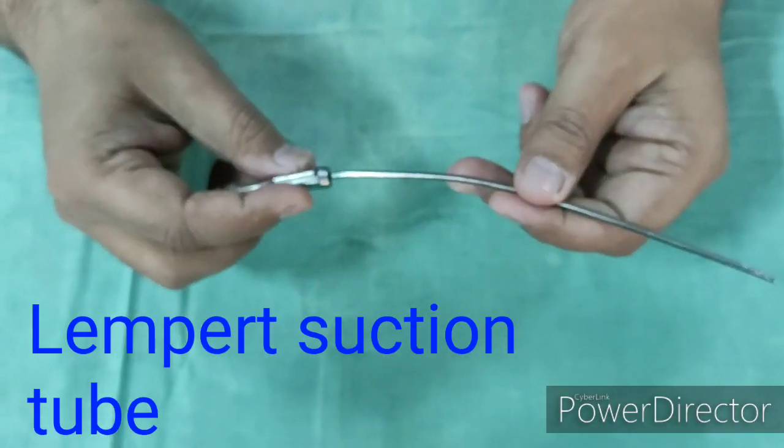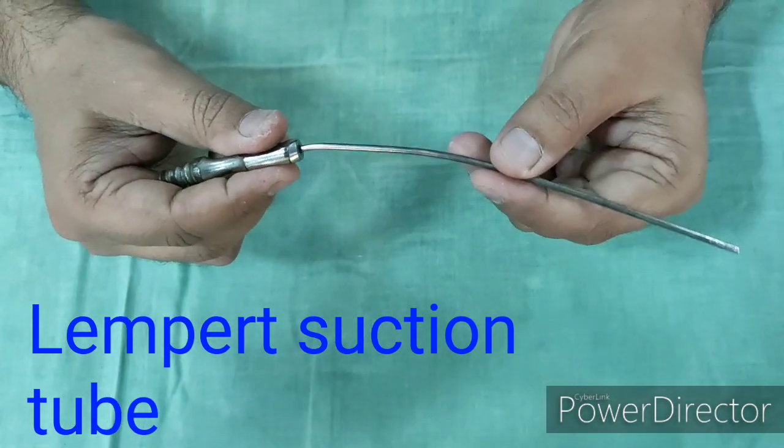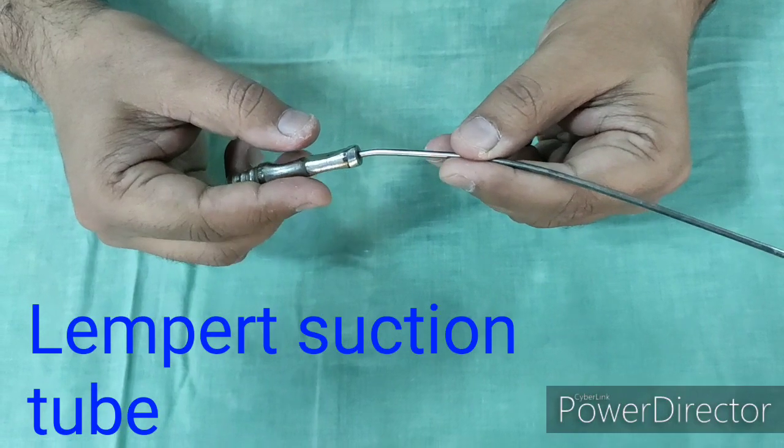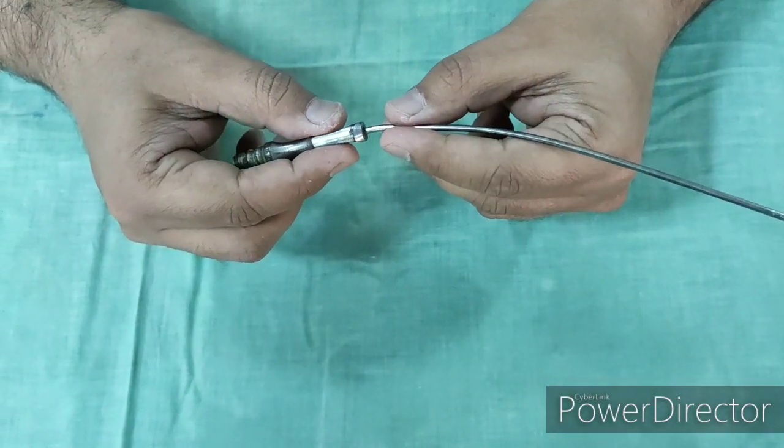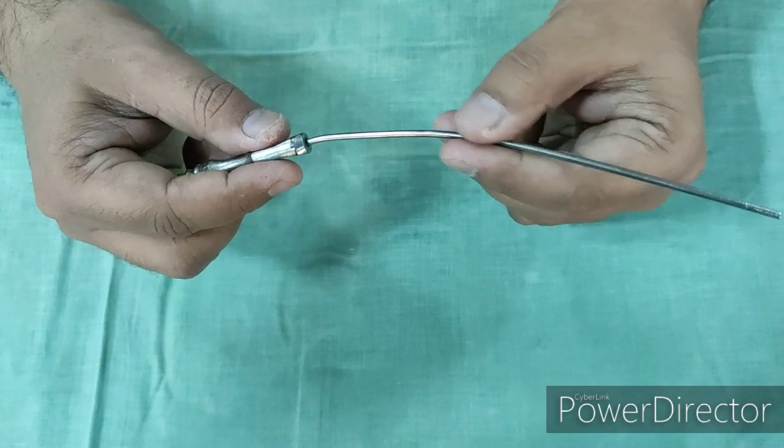This is a Lempert Suction Cannula. This cannula is used for suctioning during ear surgery such as tympanoplasty and mastoid surgery. It is also used for suctioning blood and secretions during nasal surgery, for example FESS, septoplasty, and SMR.